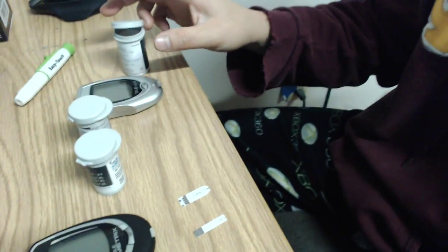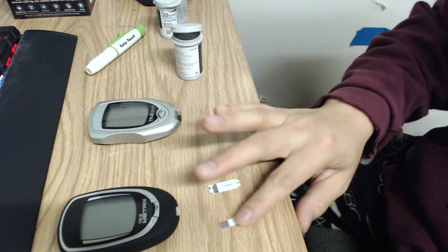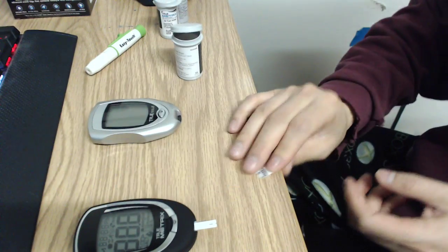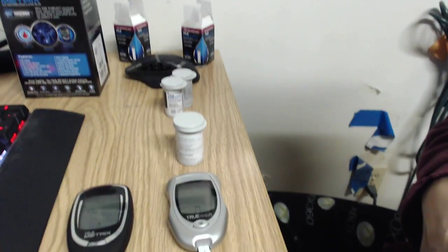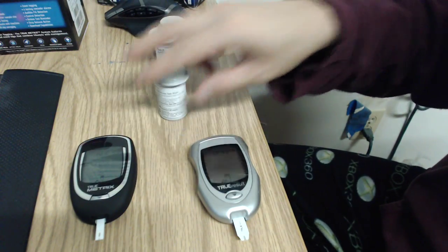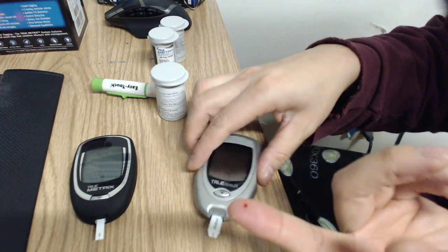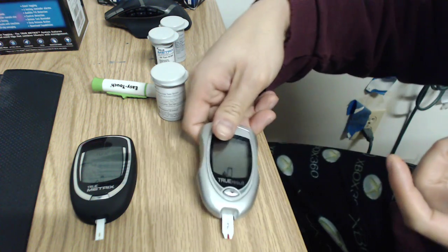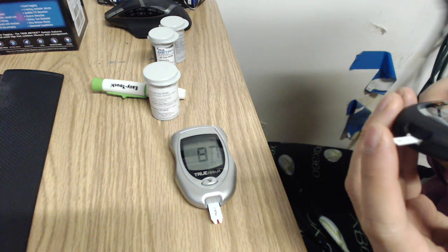Without further ado, here's what I have in front of me: the True Metrix and the True Result. I'm going to stick the test strips into the meters. I'm using the same finger — lancing my finger. It doesn't take a lot of blood, which is nice. You can see 87 right there on the True Result.